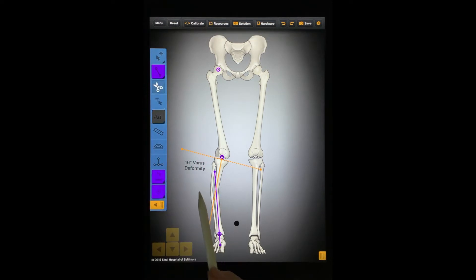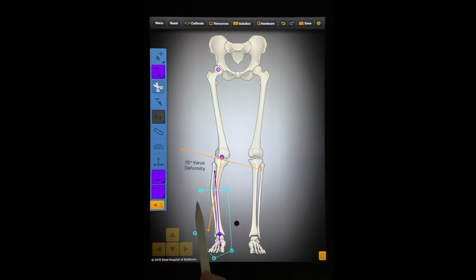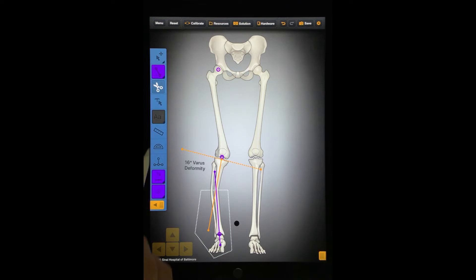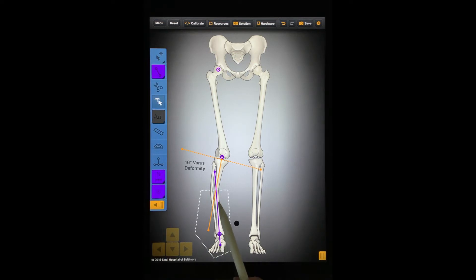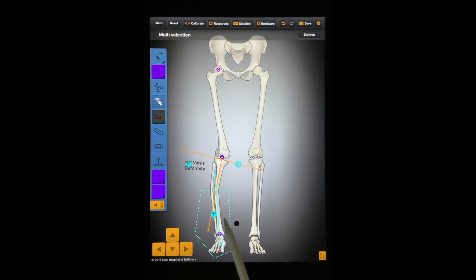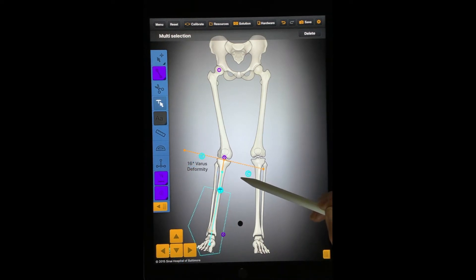Use the Cutout tool to simulate osteotomies. After you select the tool, you can encircle an object with dots. When you close the circle of dots, that area inside the dots will be treated as an object that can be selected, moved, and rotated. It can also be grouped with lines. Select the Thumbtack tool and then tap on the fragment cutout to make the thumbtack appear. Group your objects by tapping on your fragment. When you press and drag on the rotational handles, the fragment will now rotate around the thumbtack.